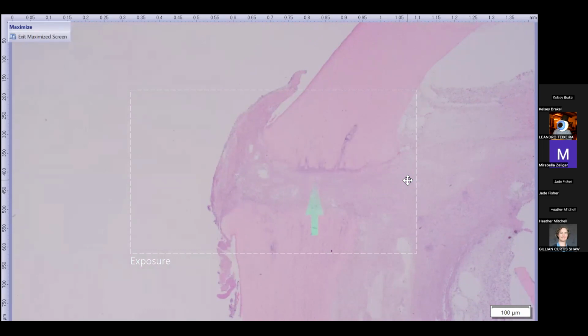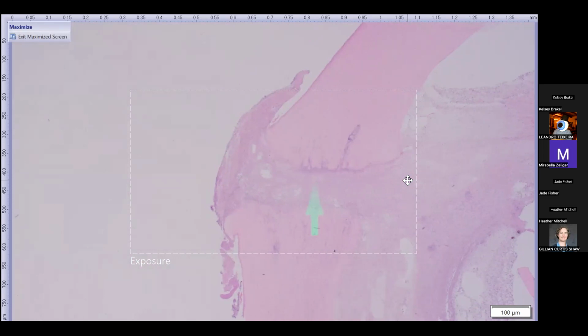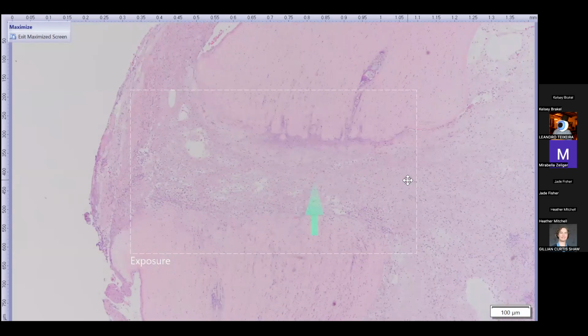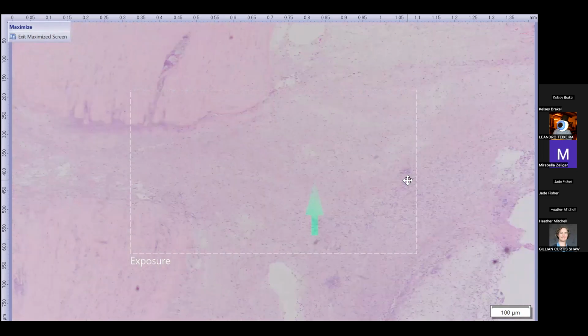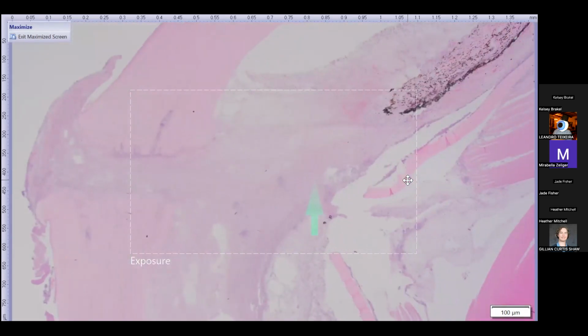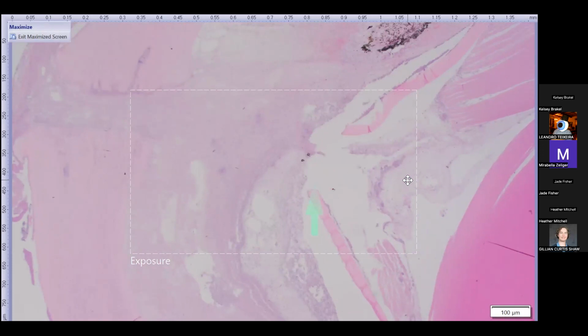It's surprising that the dog had an encounter with the cat in early to mid-July, and then lived with this for maybe 2 weeks or so before they enucleated, because this defect does not seem to have healed at all. There's no reepithelialization, and it's basically filled with this fibrinosuppurative exudate, which extends right down into the globe and is continuous with this exudate in the anterior chamber. And handily, it also corresponds almost directly with a discontinuity in the anterior lens capsule.